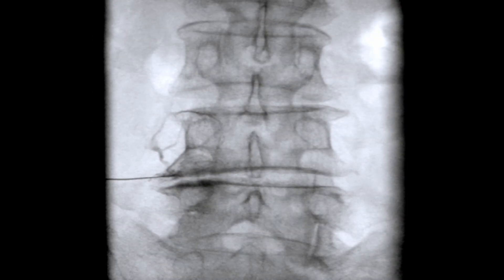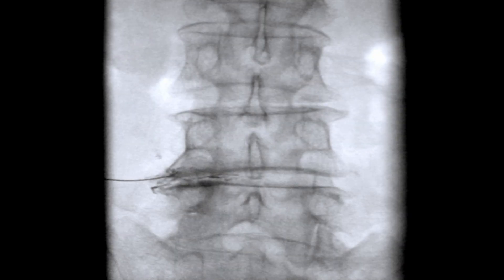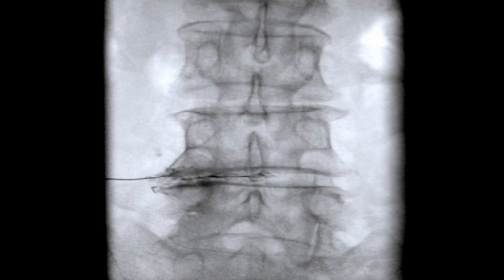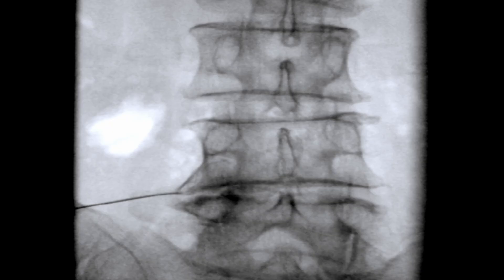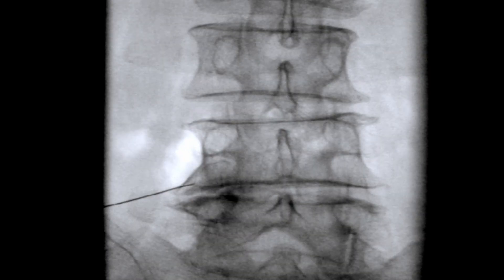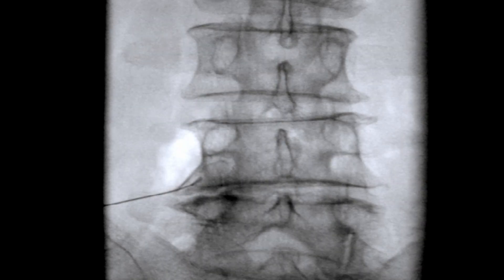Intravenous leaking and intradiscal injection occurred in the same patient in different sessions. In the next session, to avoid intradiscal injection, I tilted the needle higher than the disc level and toward the epidural space.